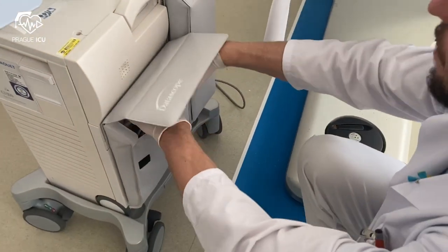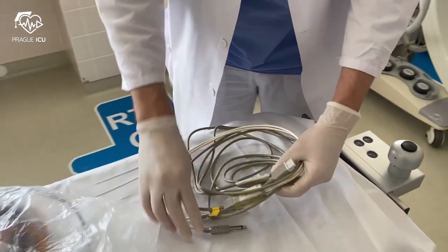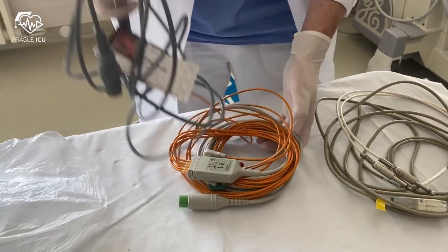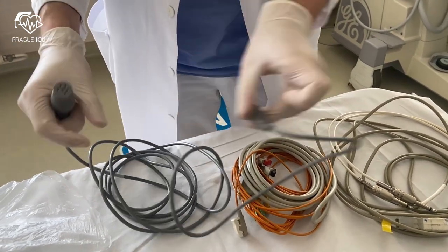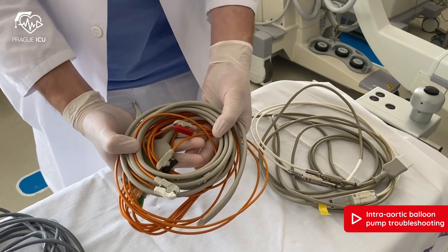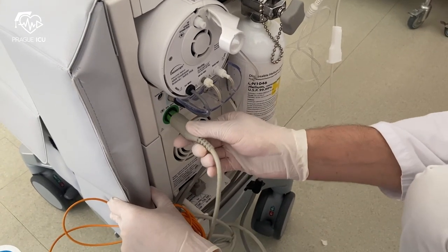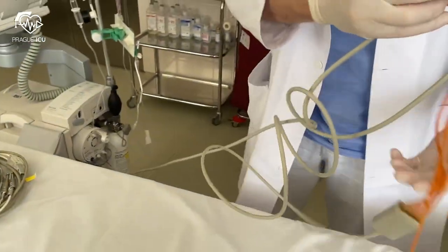In the pocket on the side of the console, you can find three cables. Cable for the external source of ECG and blood pressure. Internal pressure cable and internal ECG cable. ECG cable outlet comes to this port, and ECG leads are attached to the patient.